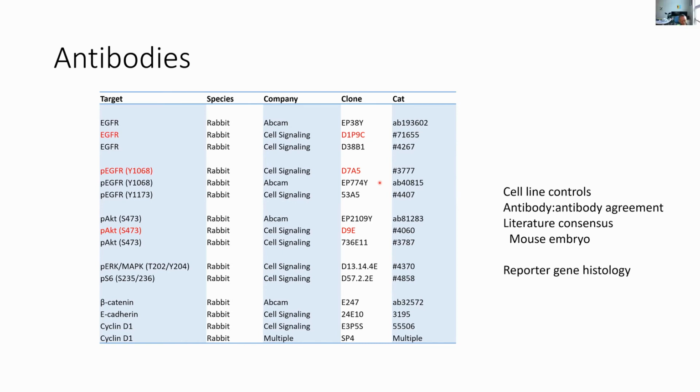Seems like a good idea, but in formalin, who knows, all bets are off, right? Exactly. Also, some of the IHC I'm going to show you is done on Swiss rolls, and as you know, it takes a lot of skill and manipulation to do Swiss rolls, especially for phosphoproteins, that might booger up the signal right then and there, and you might need to be a little more vigilant when preparing your samples.